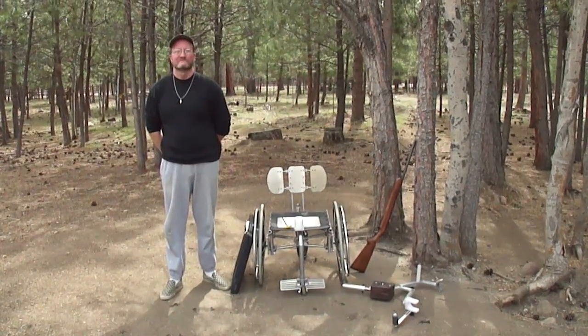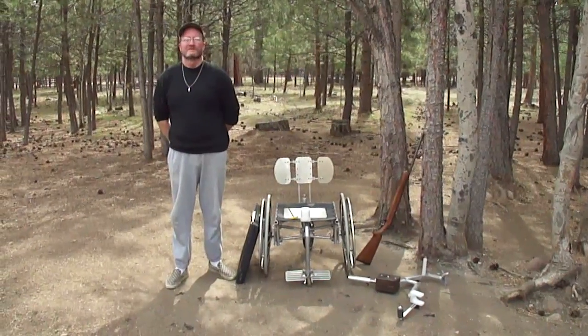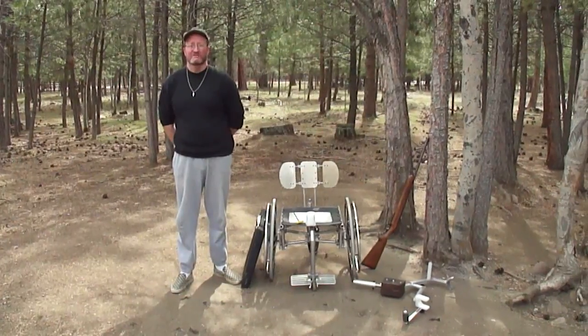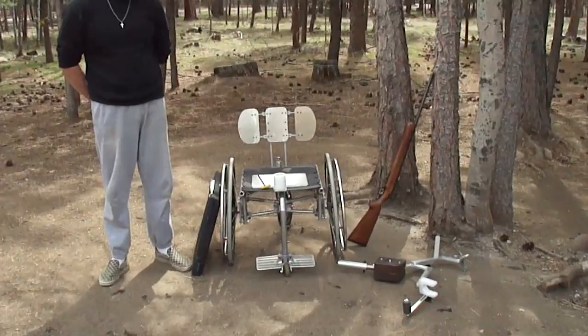We're here with Scott today. He's going to demonstrate one of his fantastic products. Go ahead, Scott. Hello, everybody. My name is Scott Brown, owner of Big Sky Imagination. And this is one of my inventions here, the rifle rest.